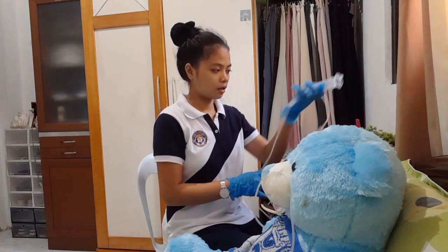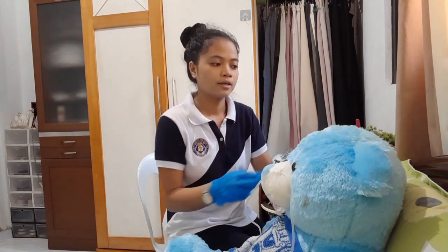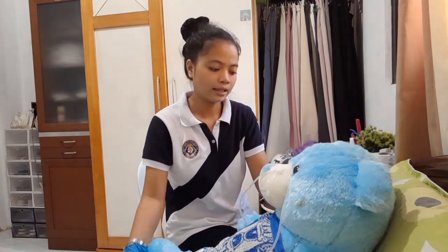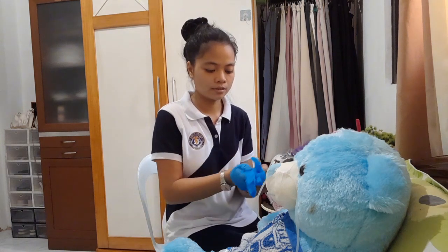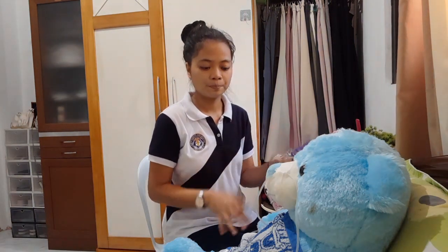Then, assuming na po naka-attach na, or then we're going to remove it. Then, assist the client to a comfortable position. We're going to administer oral hygiene or cleanse the nostril of the client. Comfortable position. Then, we're now going to remove the gloves and perform hand washing, of course. Then, record the procedure time.